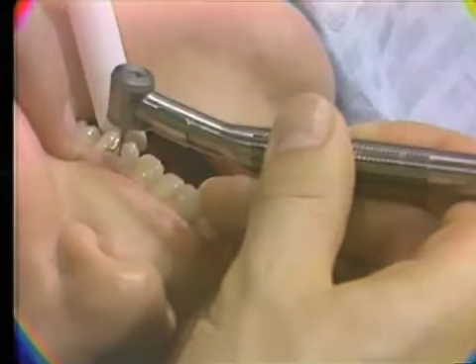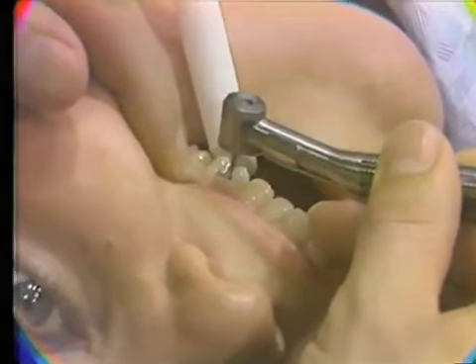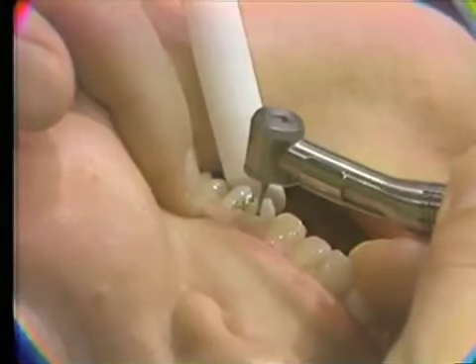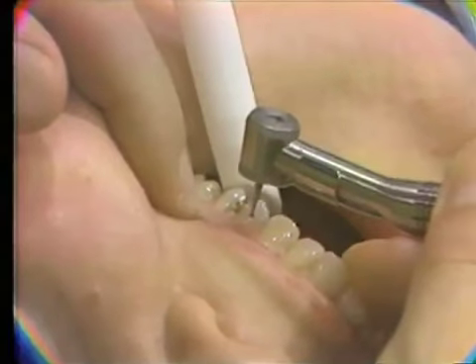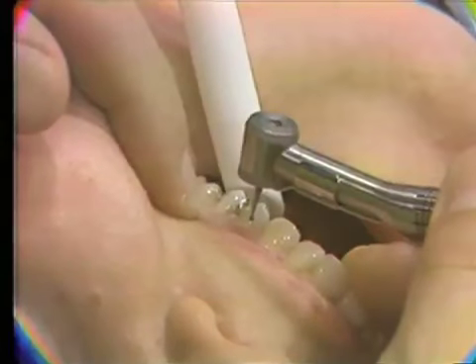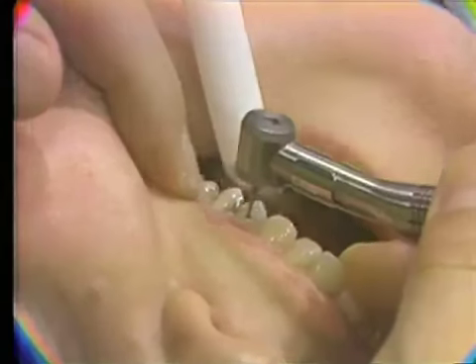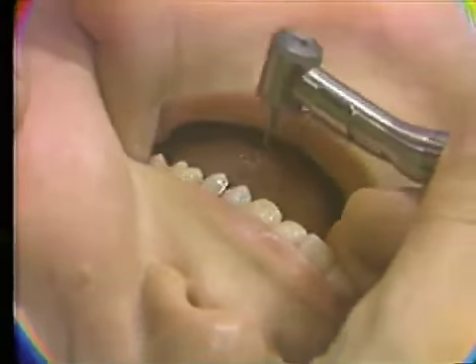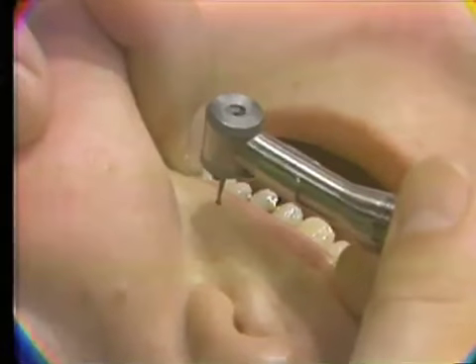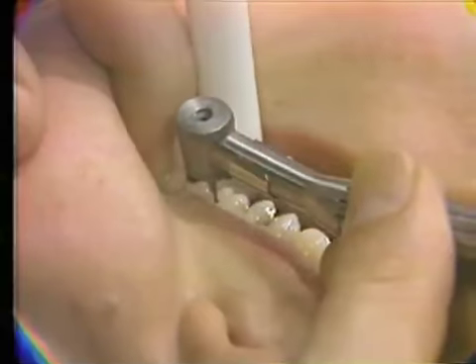Direct vision is recommended for the buccal approach to the maxillary left posterior segment. Access to this segment using the buccal approach is usually excellent when treating either the bicuspid teeth or the first molar. The second and third molars are less convenient to treat due to interference by buccal soft tissues or the coronoid process of the mandible. However, access can be improved in the more posterior area by having the patient close slightly, which moves the coronoid process posteriorly and provides more slack in the cheek for easier retraction.